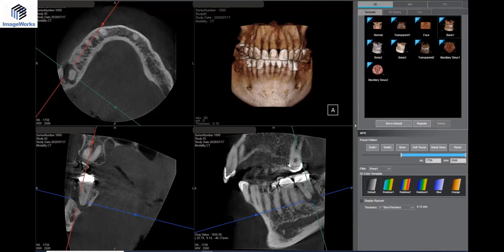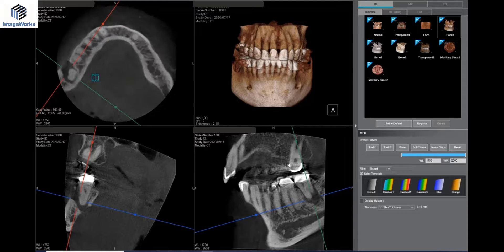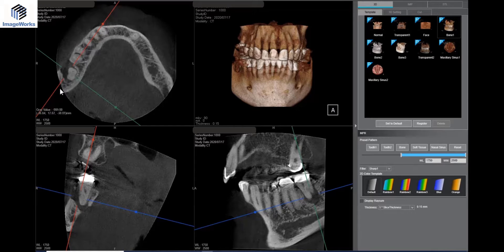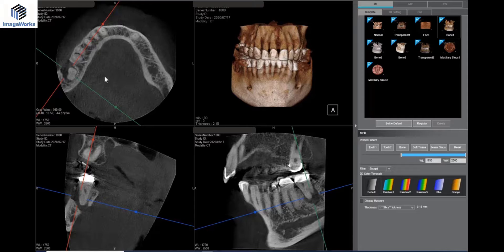The 2D picture didn't show this at all — that's amazing. So when I treated this case, I had to build up both sides, place a guided tissue resorbable membrane, and try to preserve the entire ridge, buccal, lingual, and height-wise. He's just healing right now, so hopefully doing fine.